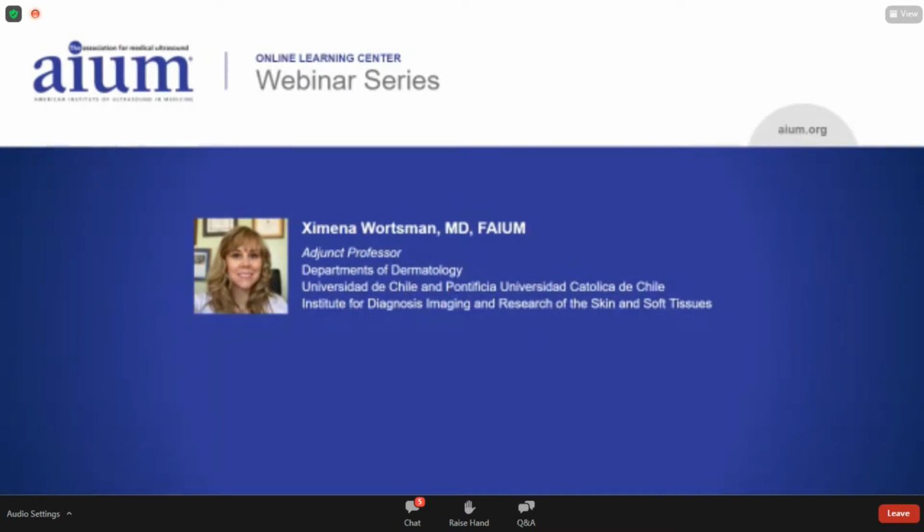Usually dermoid cyst appears as an oval or round subaponeurotic lesion that usually generates some scalloping of the bony margin. It is more common in the tail of the eyebrow. That is a very good location for dermoid cyst, but I haven't seen invasion of the bone.